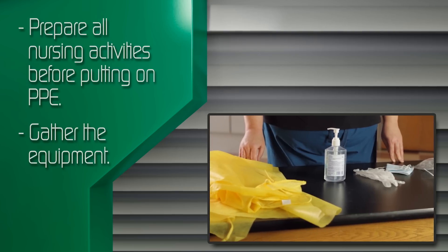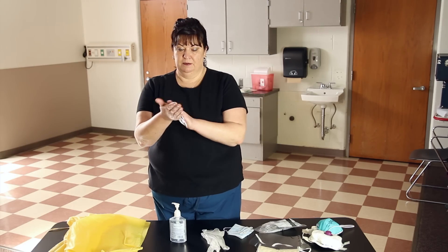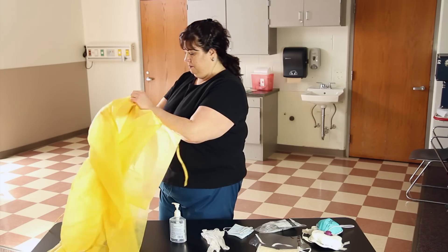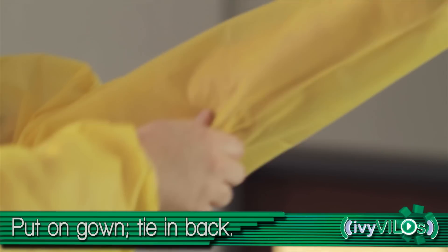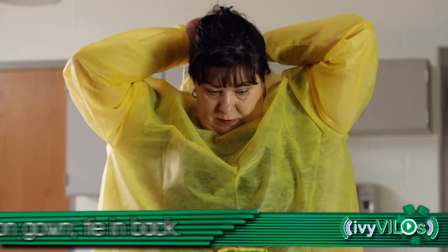Perform hand hygiene. Put on the gown with the opening in the back. Tie the gown securely at the neck and waist.